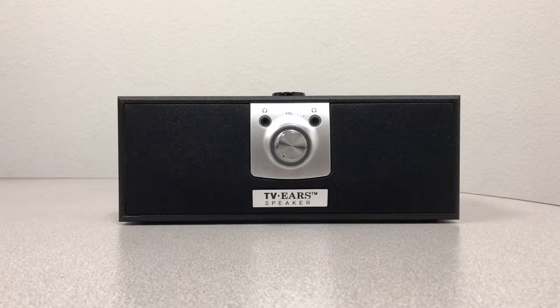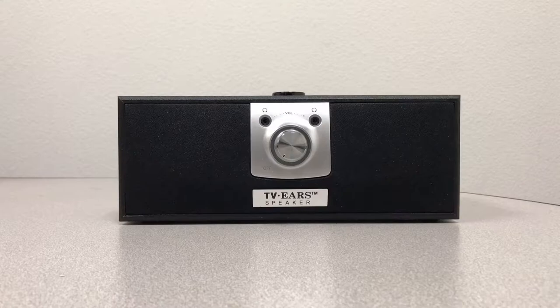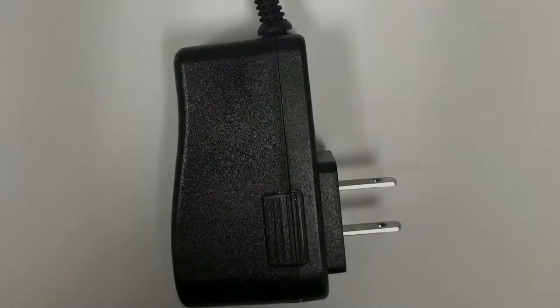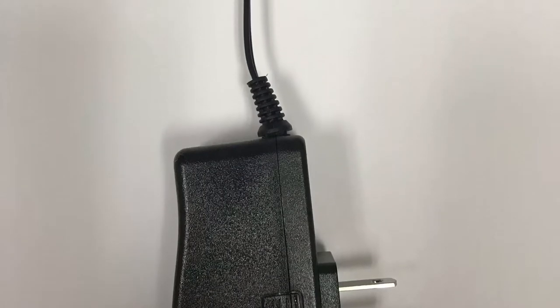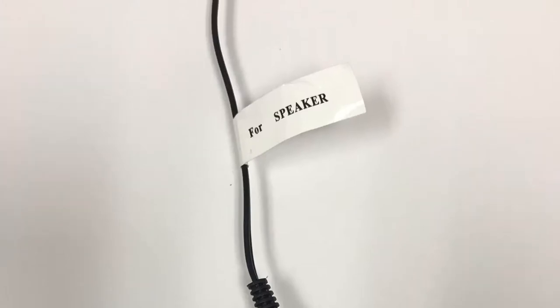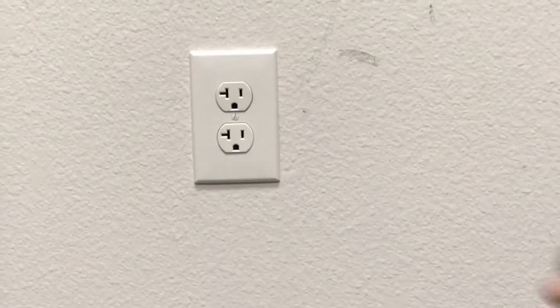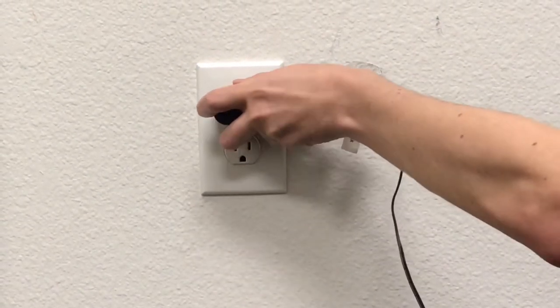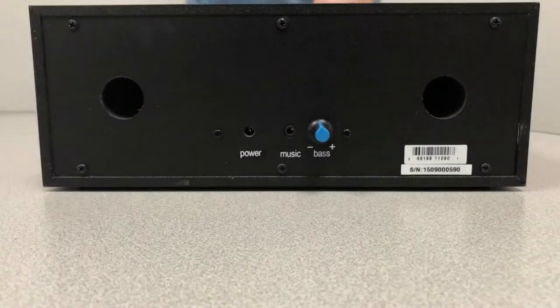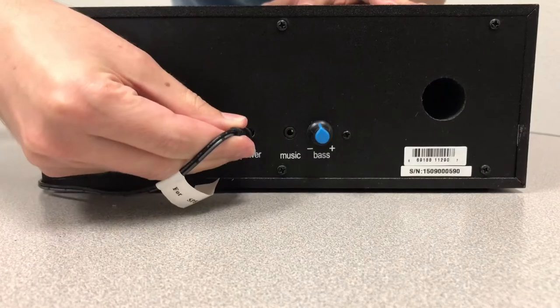This is the TV Ears speaker. It's very easy to install — you only need to connect one cord to the back of it. The cord needed should have a label that says 'for speaker.' Plug the larger end of this cord into any electrical outlet near where you sit down to watch television. The other end plugs into the back of the TV Ears speaker, labeled as power.